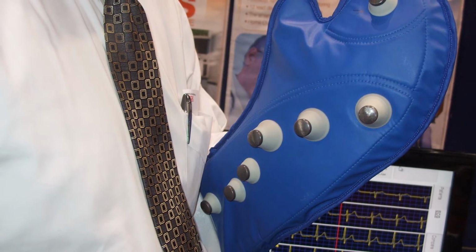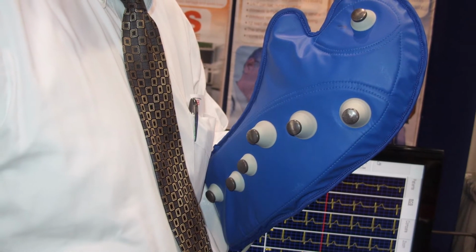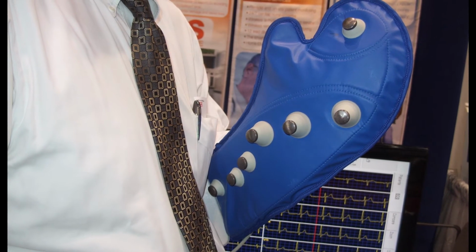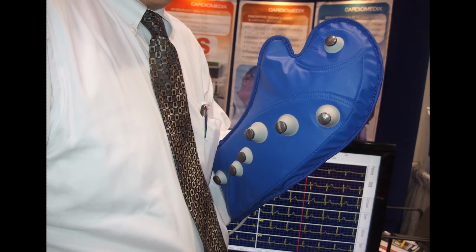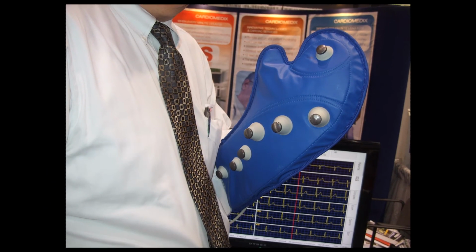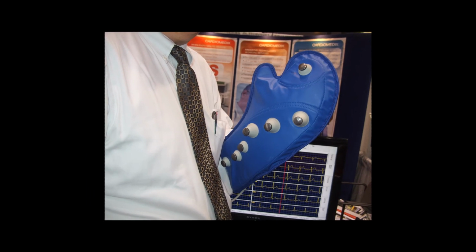One of the most innovative devices was the EMS Telemed ECG mitt, which allows fast 12-lead ECG using a glove which resembles an oven mitt. The mitt is laid across the patient's chest, and the contacts on there help make immediate contact so you don't actually have to put leads on the chest. The device is easy to use, and the company is seeking 510(k) for its use in home healthcare heart failure patient monitoring.